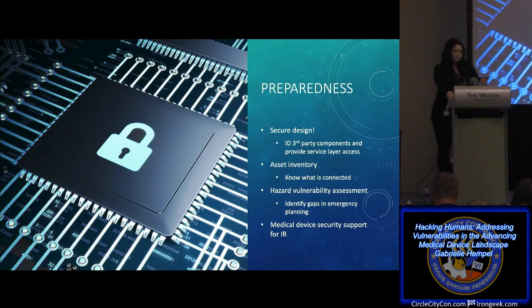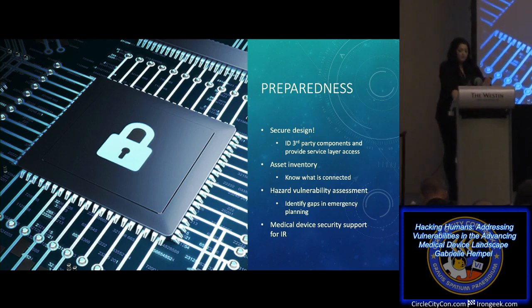The first phase that Mitre wants us to consider is preparedness. Secure design of medical devices in question is a huge concern, especially identifying and securing any third-party components that might be part of the device, and providing service layer access during an incident in order to ensure minimal disruption of clinical ops and a more rapid response.